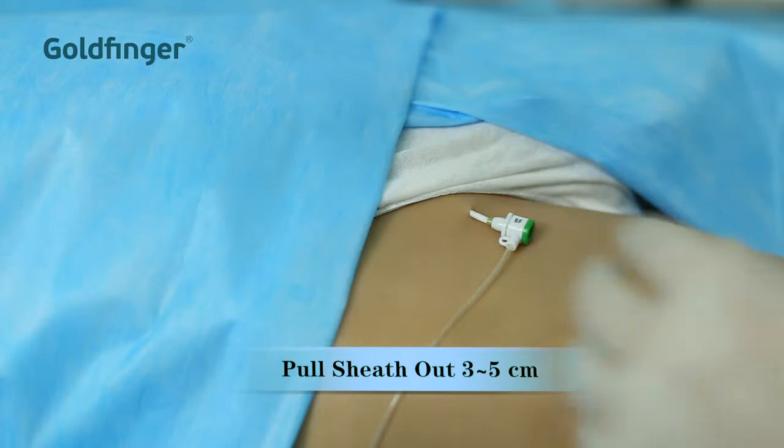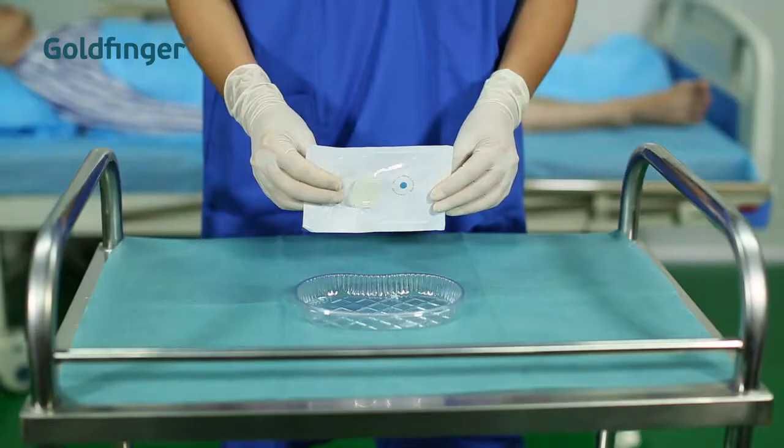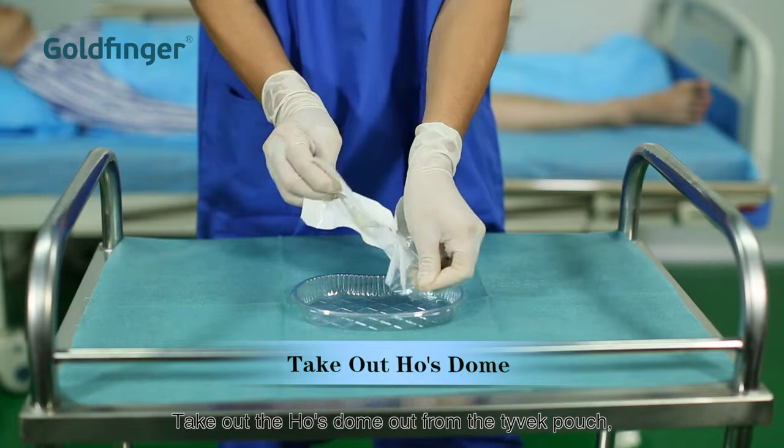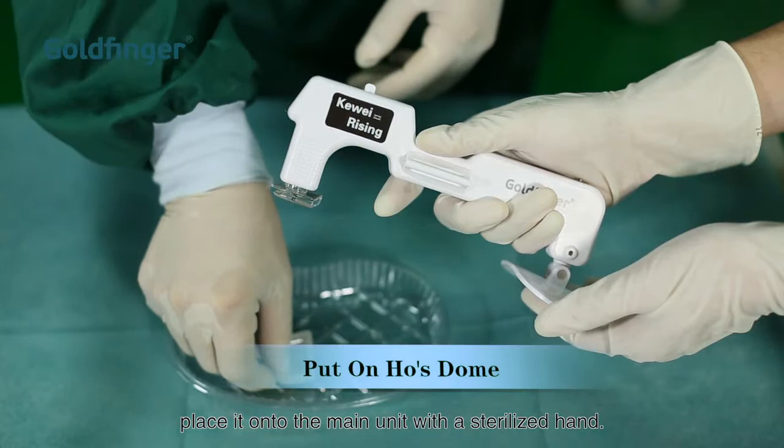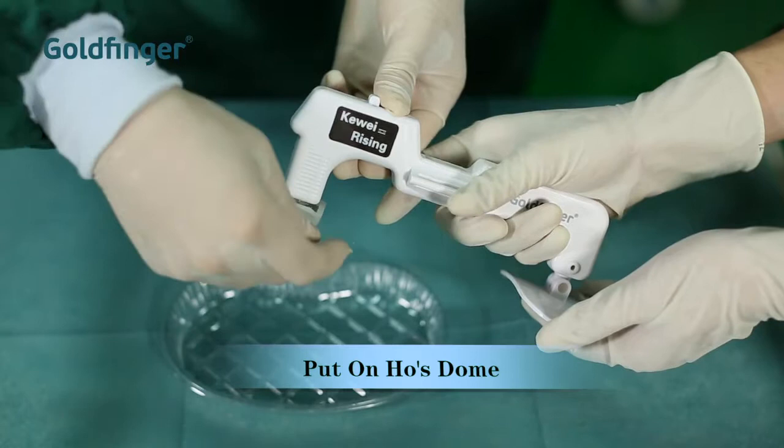Pull out the sheath three to five centimeters. Take the hose dome out of the Tyvek pouch. Place it onto the main unit with a sterilized hand.